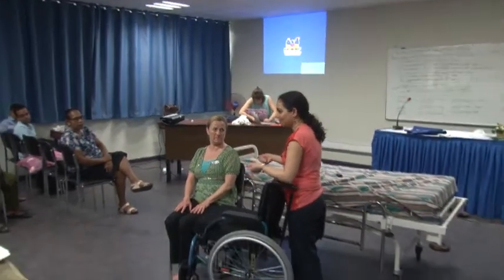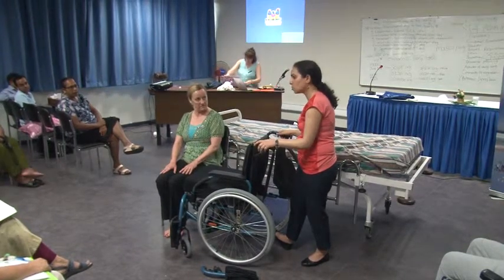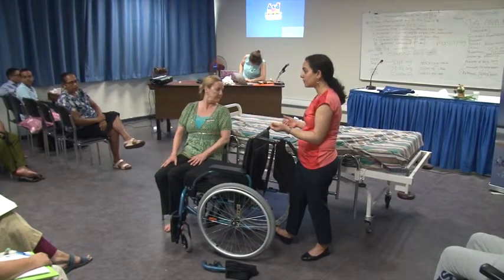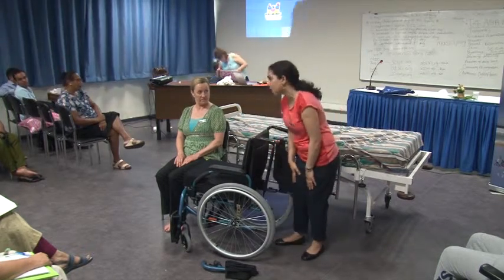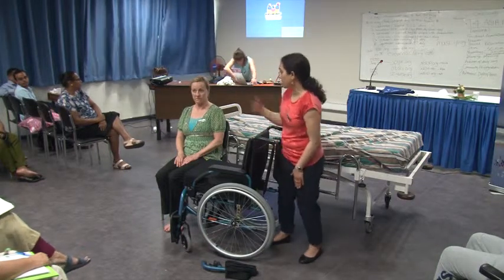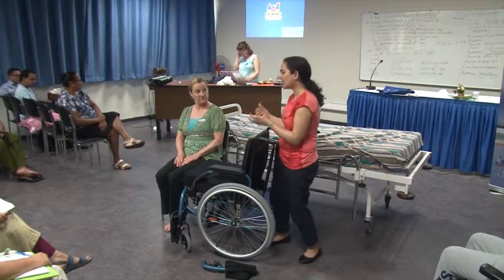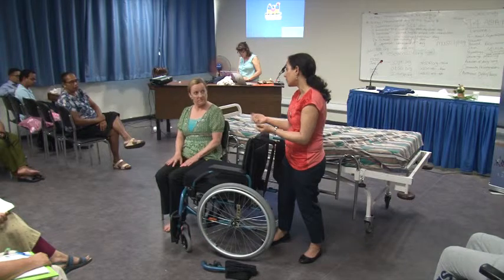But you have to look at why the person is sitting on it, right? What is more important, transfers or pressure relief? Oh yes. Okay. So I'm going to take this opportunity to also show you another product of ours, exactly what you're talking about. You lift a person only in situations where the person has some ability to get the weight on their feet. Some of the stroke patients have the ability to put weight on the good side. Some other conditions, they can lift, but it's not a good enough lift to go from one surface to the other, so you need to help in the lifting.